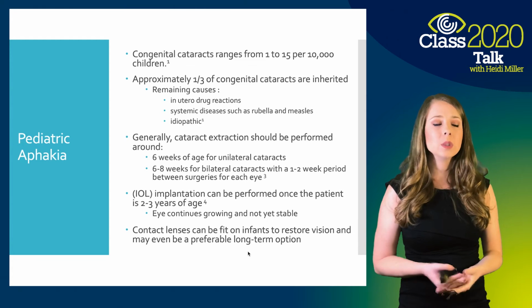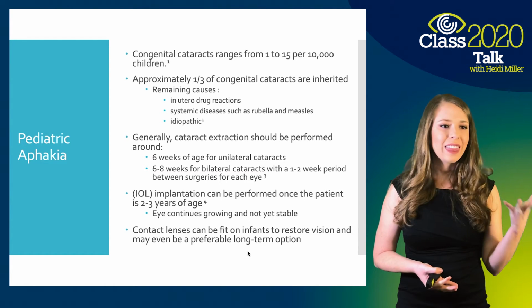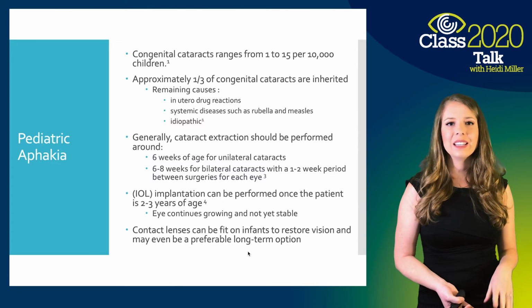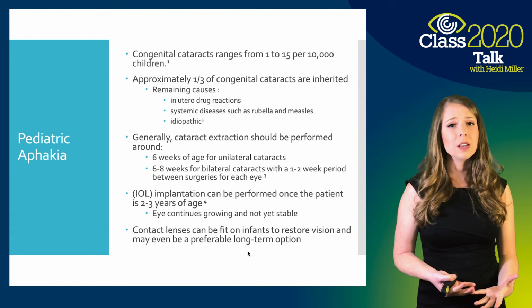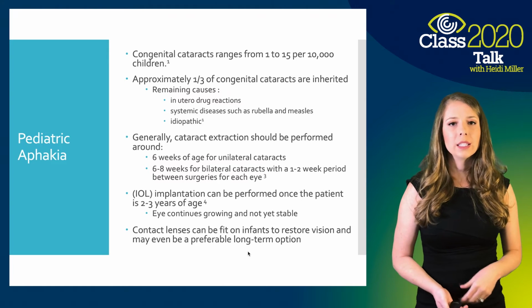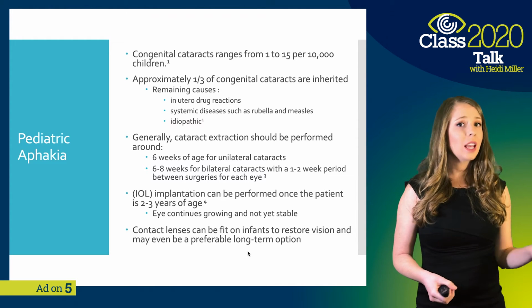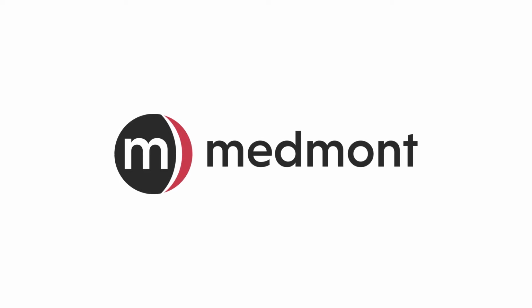But then there are other families where we're talking just like we would for someone with LASIK who's extendedly abusing their contact lenses, and maybe that's an option. Same kind of idea: if compliance is an issue and we're losing lenses a lot, we start talking about the risk factors of having permanent vision loss related to amblyopia, and they become a good candidate for IOL implantation sooner. So just as a reminder, contact lenses are fit on infants to restore their vision, and it could be a good option for the long term.